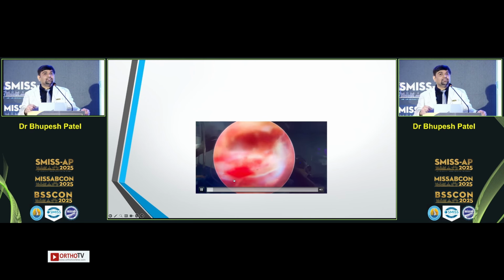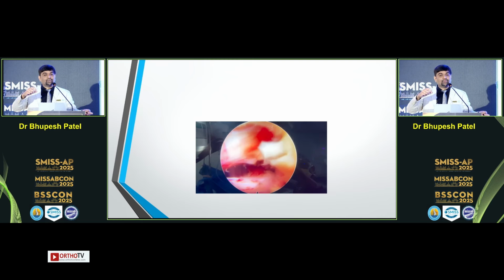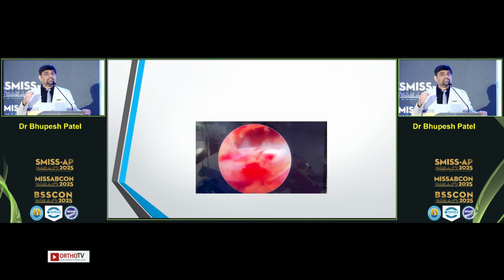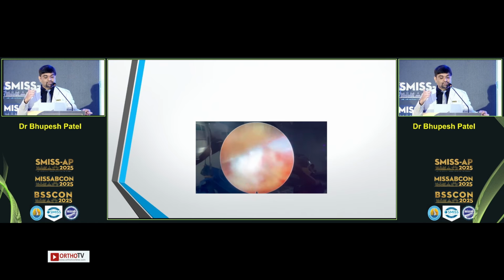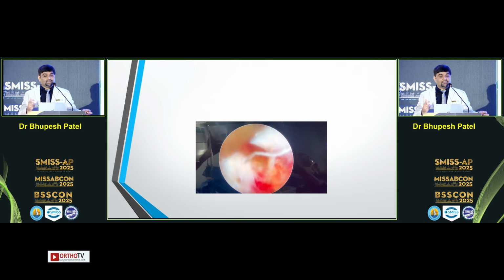So with retraction, with a smaller scope, your cannula can retract the root and you can do aggressive discectomy, which is not possible with a stenoscope with a working sleeve, because every time you are traversing, the nerve root is always in the way. So you are always afraid of damaging the nerve root or grabbing the nerve root. So a smaller scope here matters a lot.